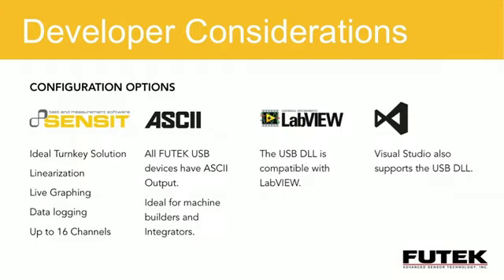So the FUTEK USB devices have a continuous streaming output feature. The ASCII output can be used by any software application that can read serial data from the COM ports.